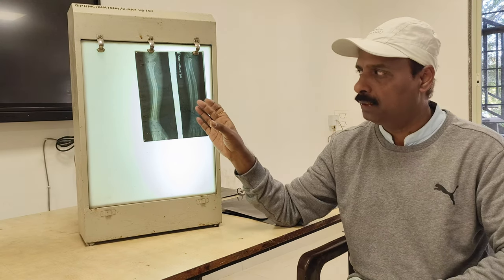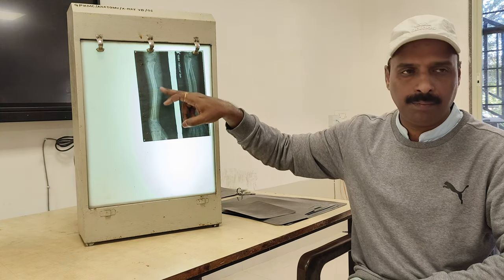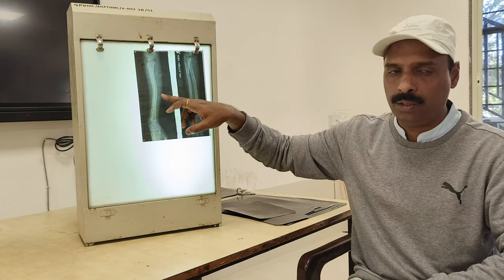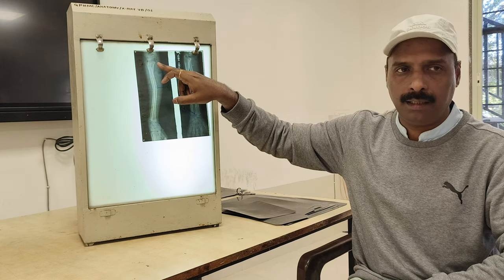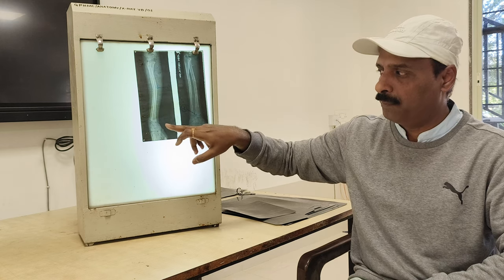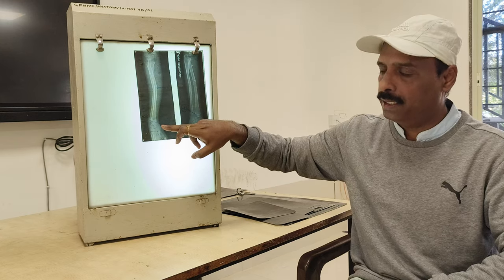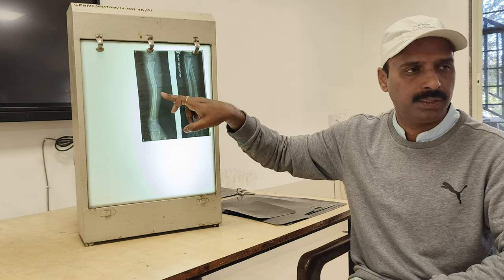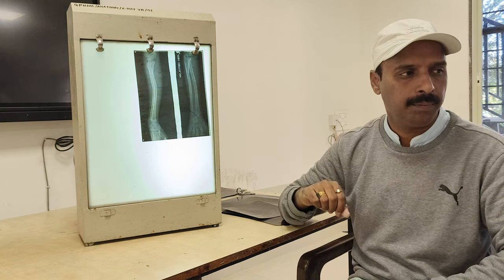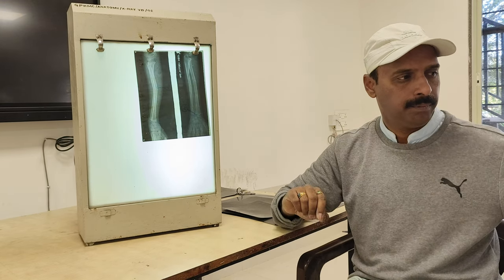How to comment on this? This is an x-ray of the forearm. A plain x-ray showing the forearm bones, the radius and ulna. Then we have the lower end of the humerus and the upper end of the radius and ulna. Here is the lower end of the radius and ulna, and we have the wrist joint. So the elbow and wrist are covered in this. Then the fracture line is seen here.